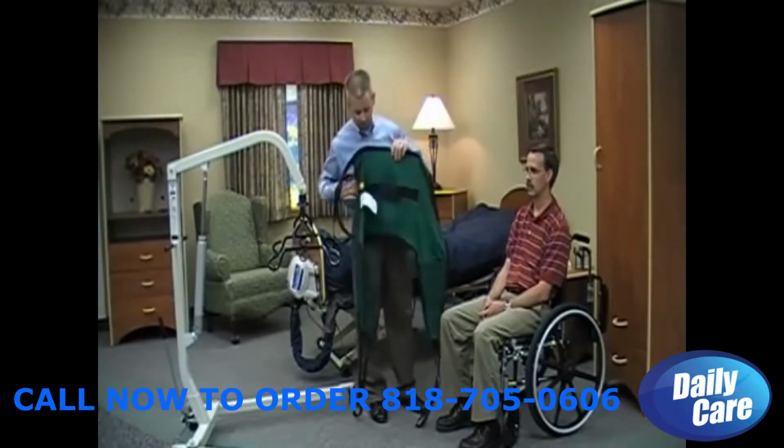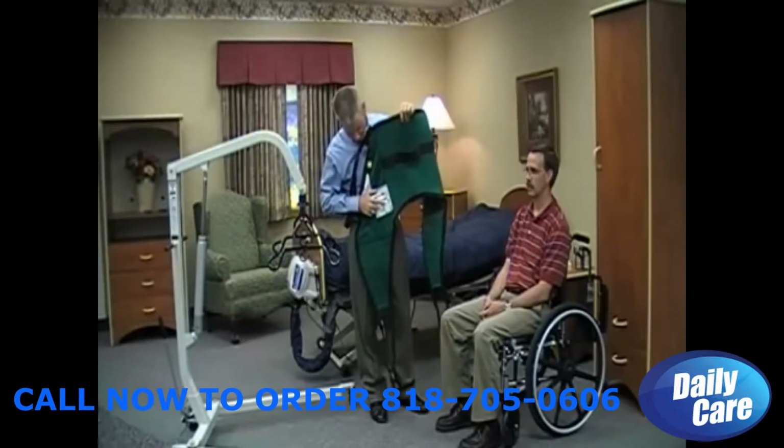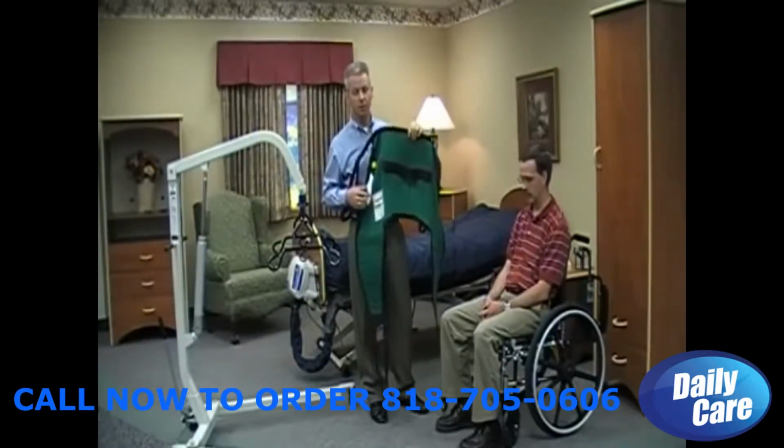Now the next thing we want to talk about is the universal sling. And this universal sling has a label on the side that tells me that this is a medium sling. We want to ensure that we have the proper size because we don't want to use a sling that's either too large or too small for the resident in question. We want to ensure that we have the proper size sling.